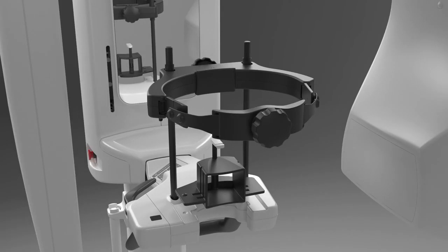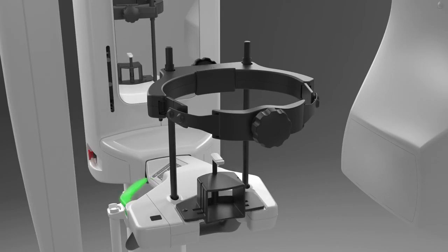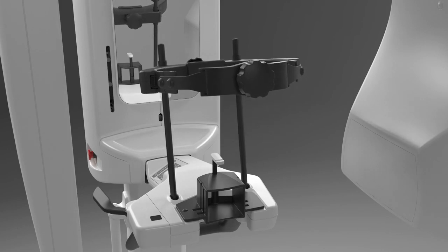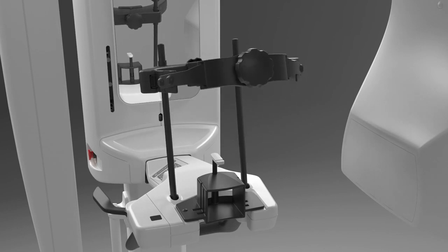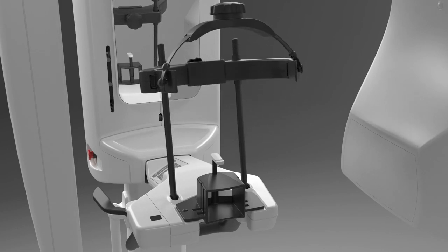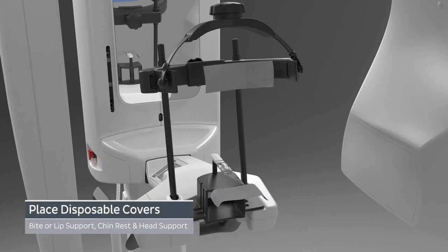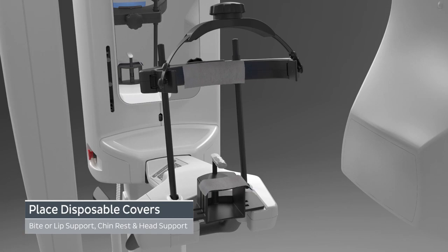Pre-configure the chin rest and place it into the system. Release the head support locking lever and move it towards the patient mirror. Pivot the back portion of the head support into its upright position. Place disposable covers on the bite support or lip support, patient chin rest, and head support.